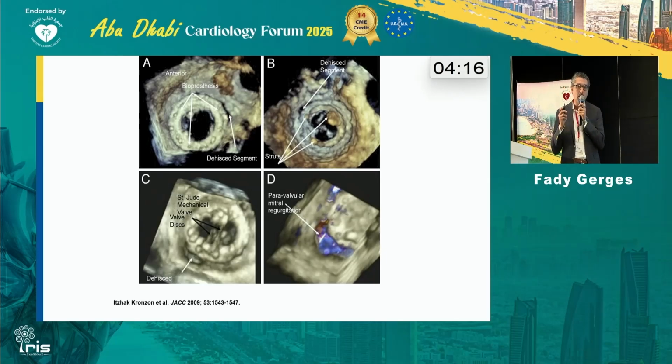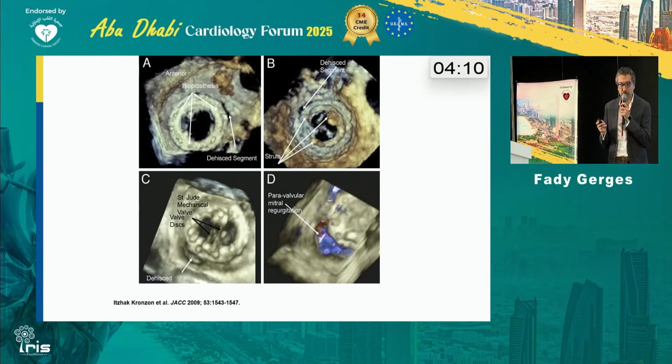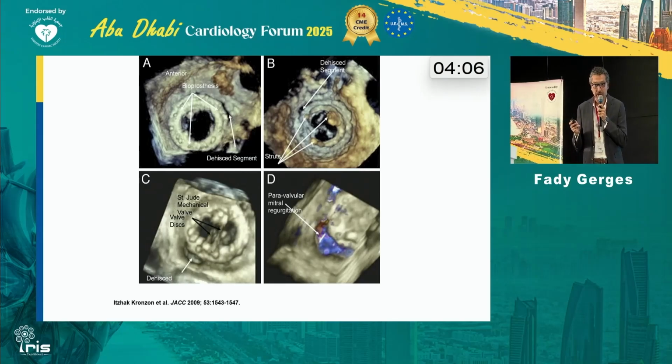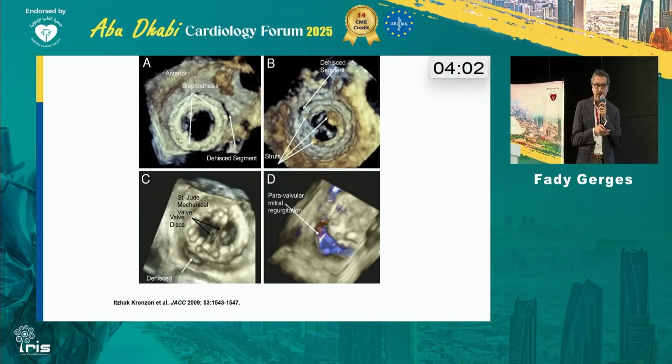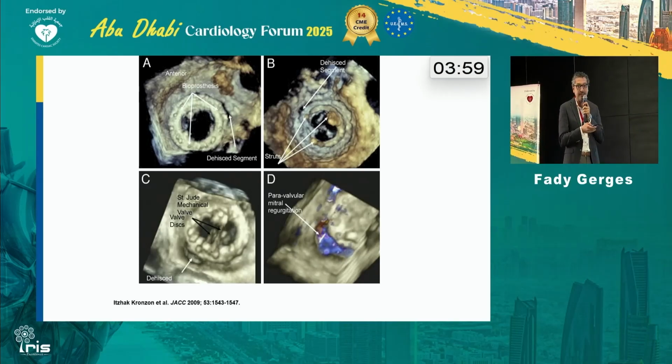Usually, if you have one gap or one paravalvular leak, in high-risk patients or even in moderate-risk patients, you don't have to take the patient to surgery. You can use an occluder. They call it a PDA occluder. So it's a very easy procedure now. It's done by the interventional structural doctor as well as the TEE operator. It has to be under 3D TEE.